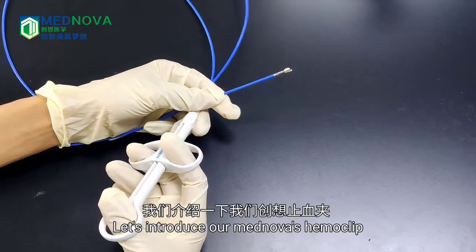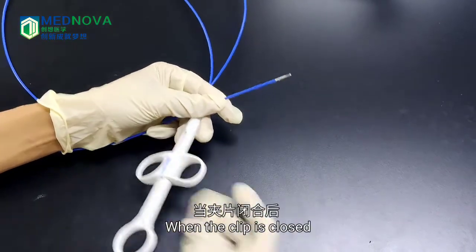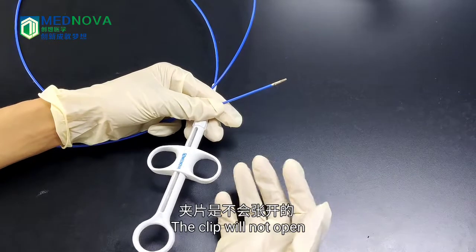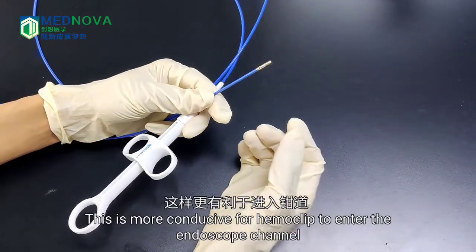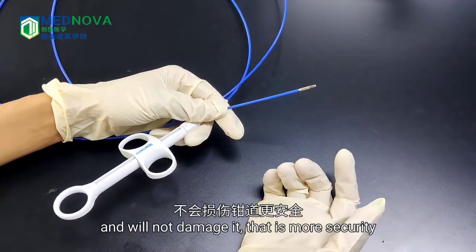Let's introduce our MagNova Hemaclip's unique self-locking function. When the clip is closed, your hand can leave the handle and the clip will not open — it has a self-lock. This is more conducive for the Hemaclip to enter the endoscope channel without damage, providing greater security.